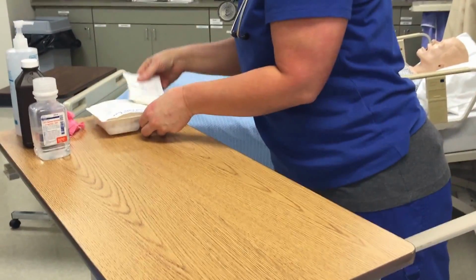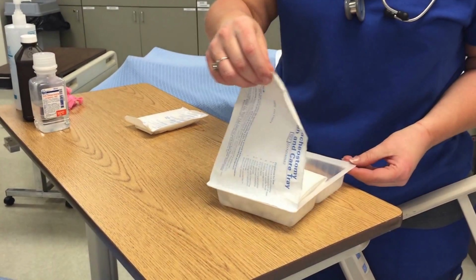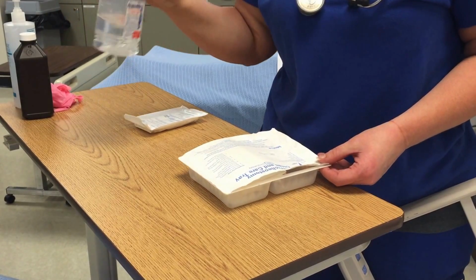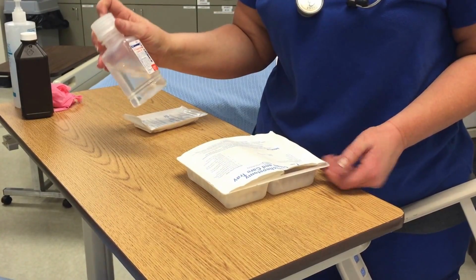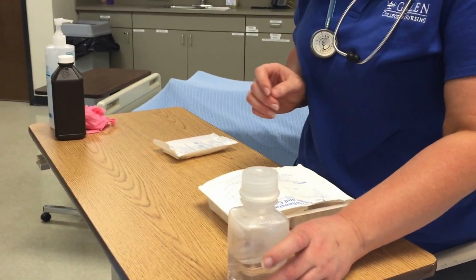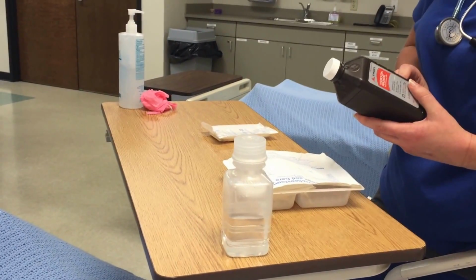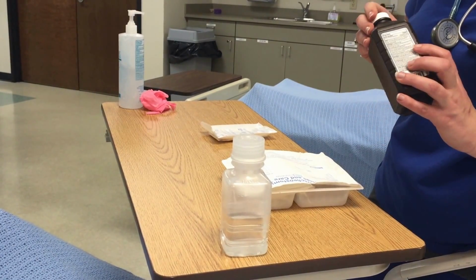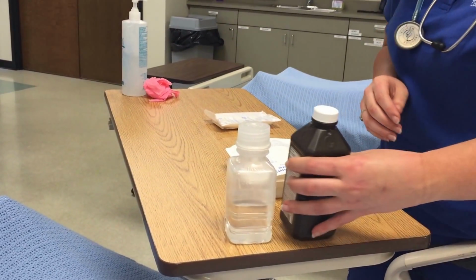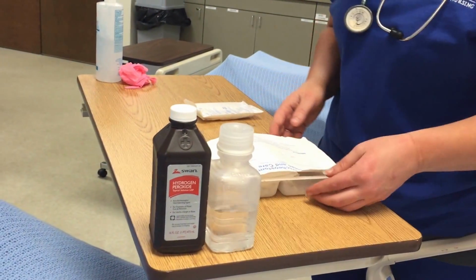All right, Miss Dan. I'm going to set up our trach set. And again, we're using our same saline bottle. I had inspected it. It was not contaminated. It was intact, and the expiration date was good on it. And we're going to do the same thing for our hydrogen peroxide. The lid is good. It is secure, and it does not expire till August of this year, so we're good on that one. All right. So we're just going to set that right there for now.